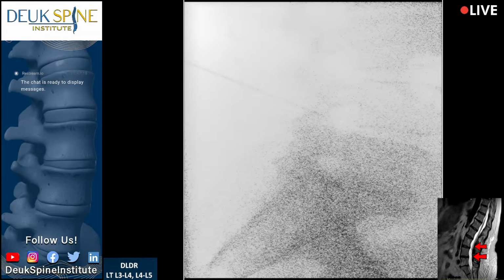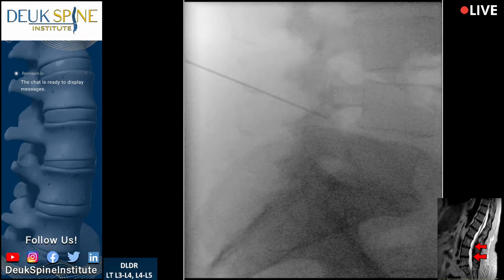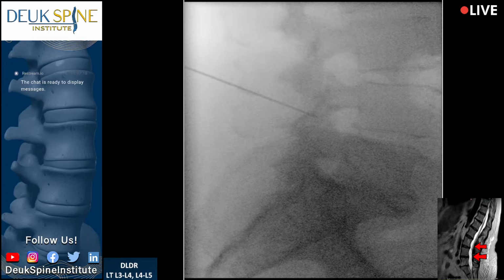That's part of the reason she's having so much pain, is that that joint is just enlarged, much bigger than it should be, and it's full of arthritis. You're doing great. Lay still, Sean. So not only are we fixing her herniated disc, we're also fixing that facet joint.